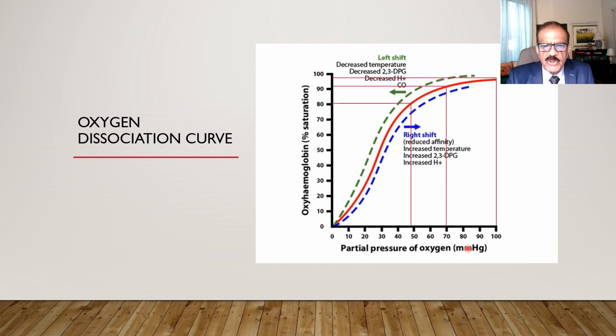Partial pressure of oxygen has dropped so much. At 61 he developed cyanosis. So from 100 it has come to less than 50, and the oxyhemoglobin percentage saturation is only 84, 82. So not that much. That means we can't really trust pulse oximetry, and it can't be taken as a substitute or alternative to proper arterial blood gases.